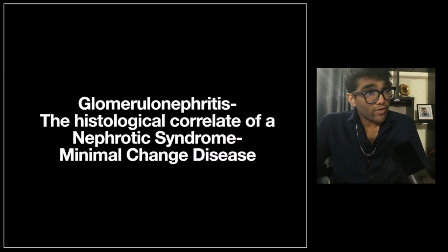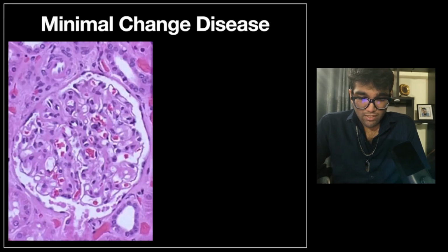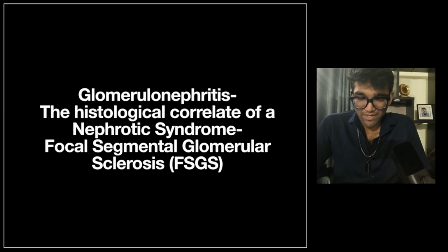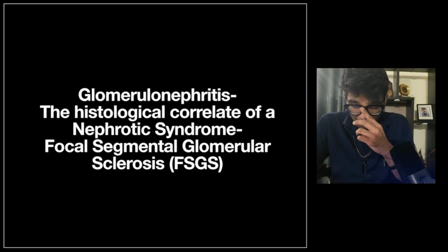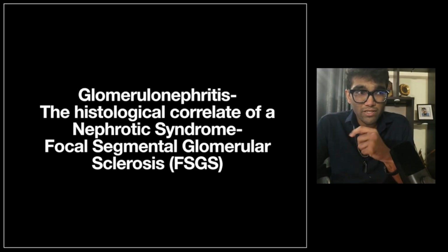Now, going on to the second entity, that is minimal change disease. In minimal change disease, you find nothing. There is minimal change, so there's nothing there. It's completely normal. So how do I say it is minimal change? Usually biopsy is not performed for minimal change disease. But if you really do have a patient with minimal change disease, especially adult minimal change disease, it is prudent to get an electron microscopy study, although in normal clinical practice we don't normally do it. So I will leave it at that.